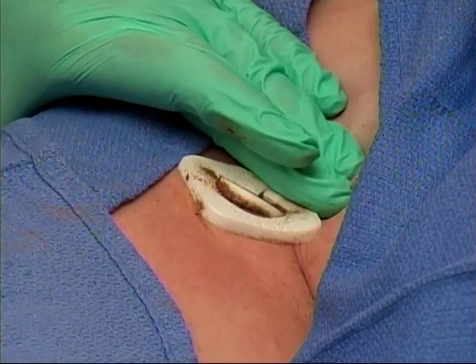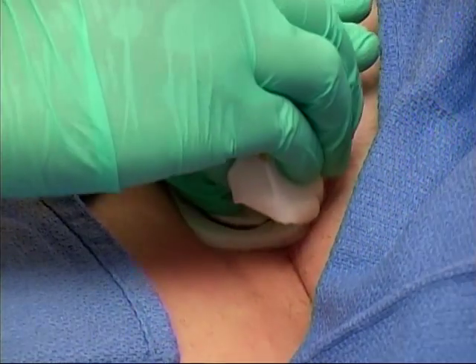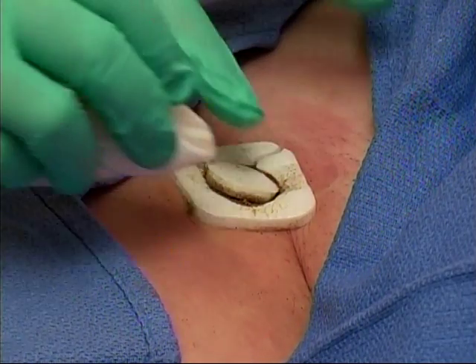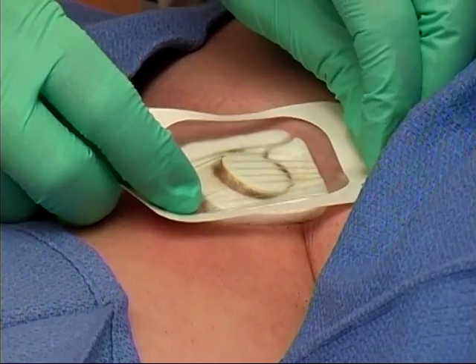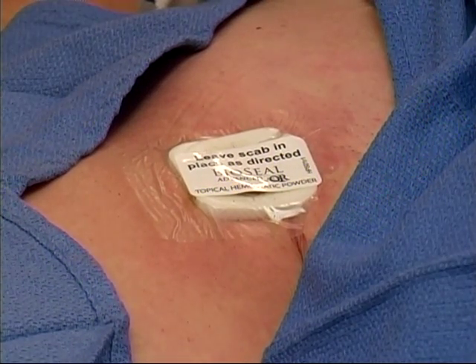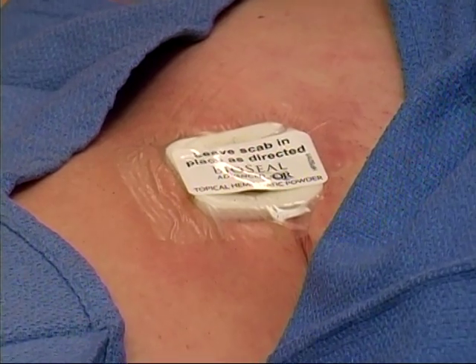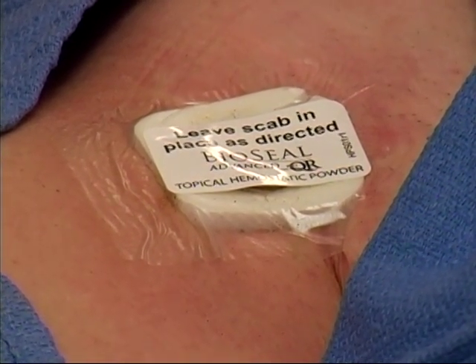Release pressure slowly, rolling your fingers off the PCD. While stabilizing the PCD center, gently clean the PCD with clean gauze as needed. Dress the site securely with a transparent dressing or tape. Place the BioSeal Advanced product label on top of the dressing to identify the powder. Follow your normal ambulation protocol, and finally, provide the discharge instructions to the patient or caregiver.